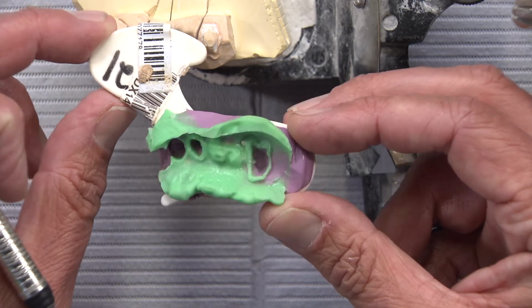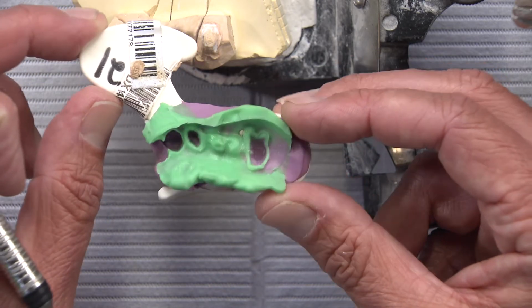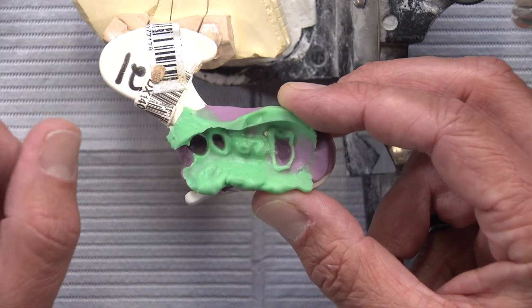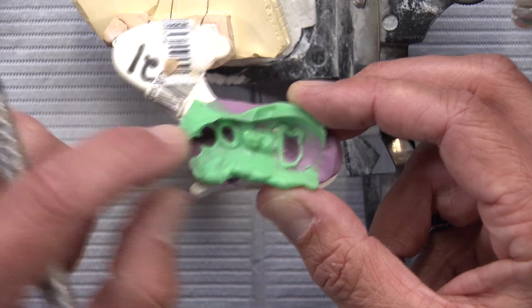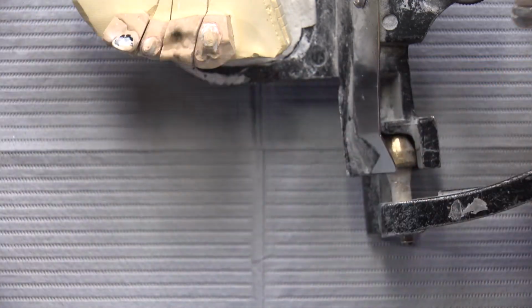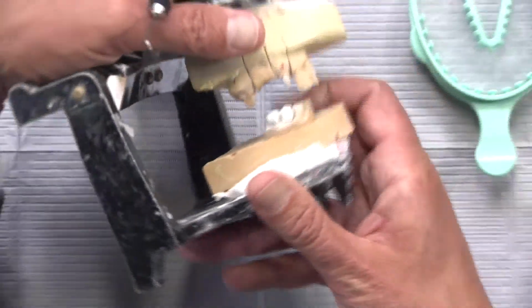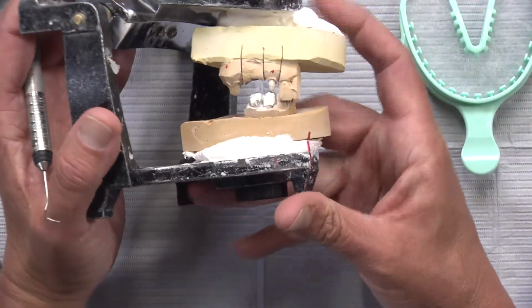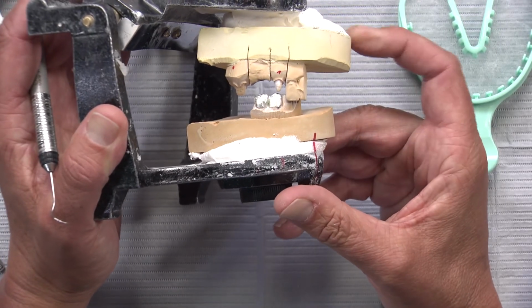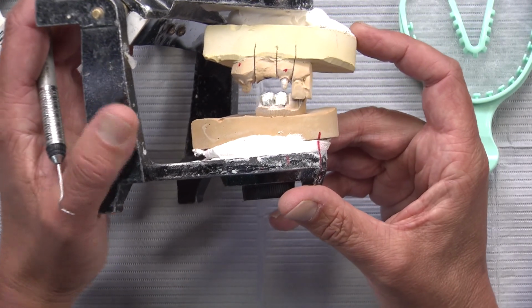So again, the best way to do this is going to be with a metal tray, full upper, full lower, and a bite registration on these 2 teeth. Even though there's not an opposing one here, with the bite registration on the anterior prep and the tooth across from that, we're going to be able to work with that, considering that we have all these other natural teeth on the other side that are going to be in occlusion as well. And so that's the right way to do this.